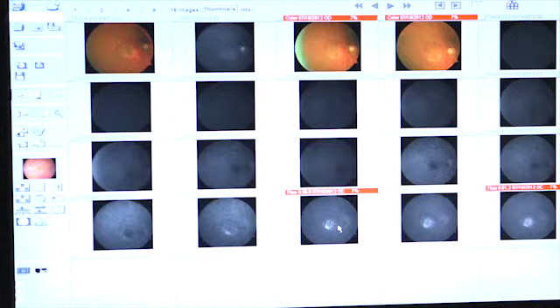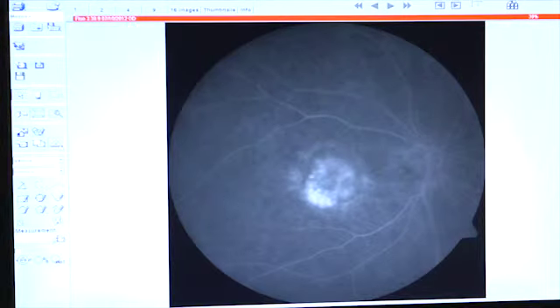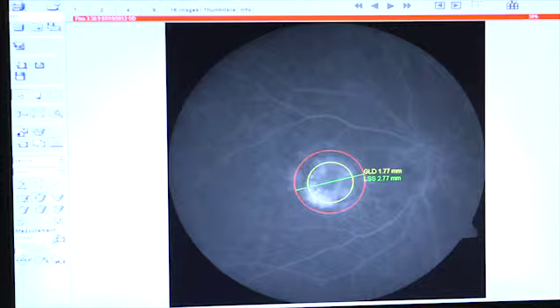While much of the information we get from a fluorescein angiogram is subjective, certain objective data can be generated to help with specific treatment. Here, laser settings are being calculated for a treatment called photodynamic therapy. More on this treatment option later.